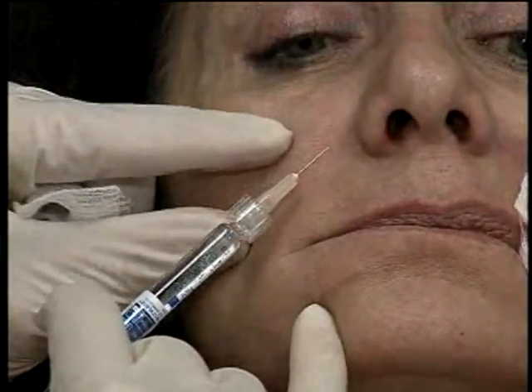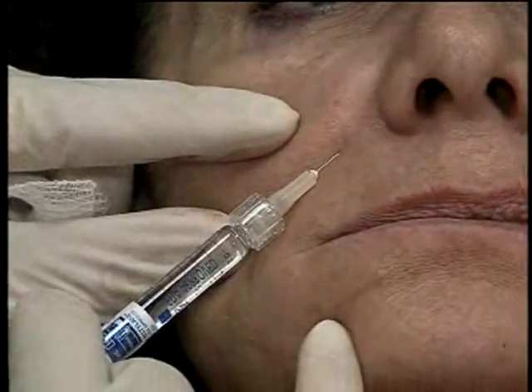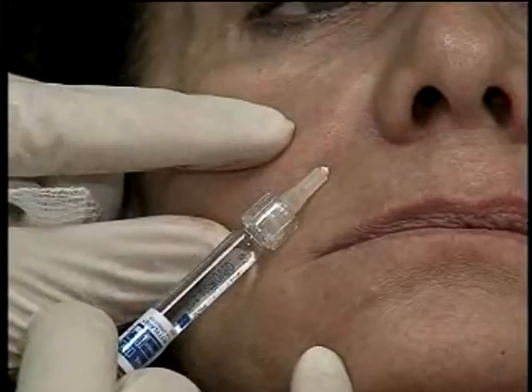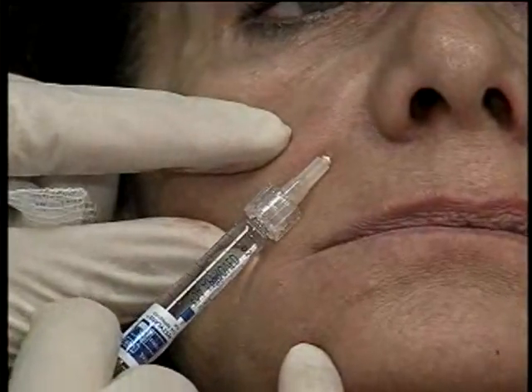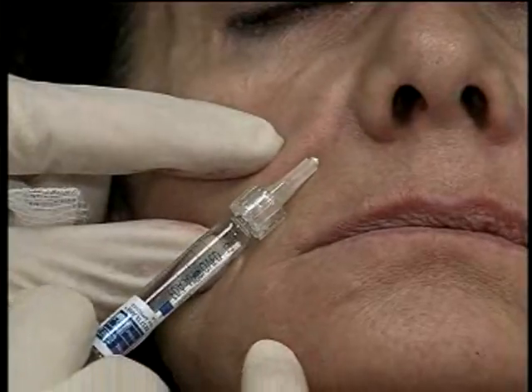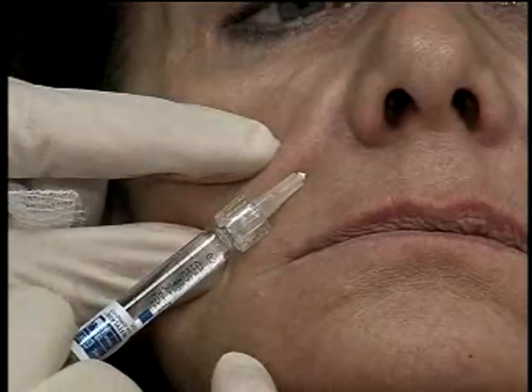I start as superior as possible into that triangle. I'm in the subdermis because I like being in the subdermis. I could be in the dermis, which is right here. But I'm in the subdermis now, and I go slow and purposefully while I inject a little product.